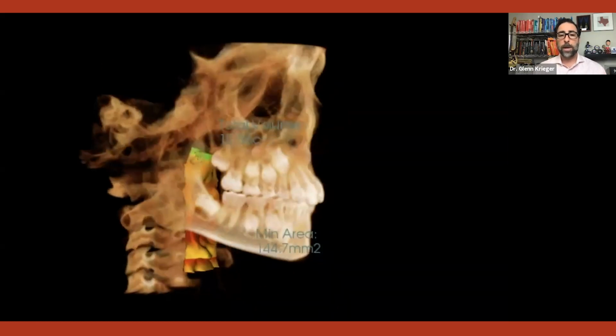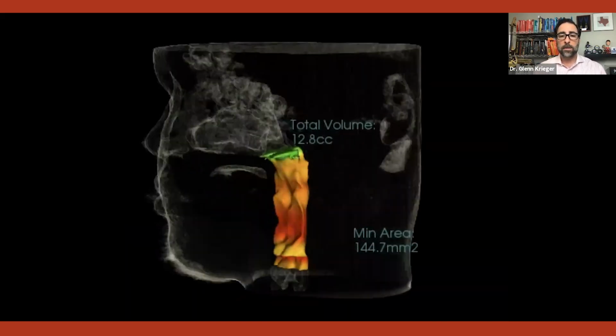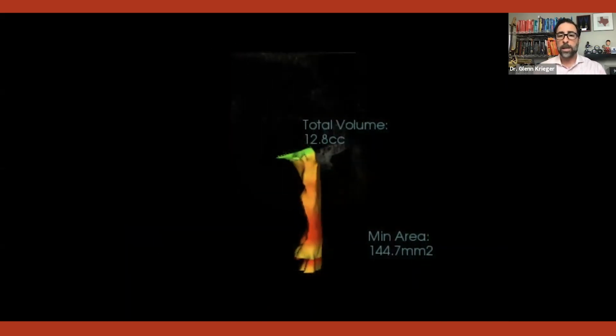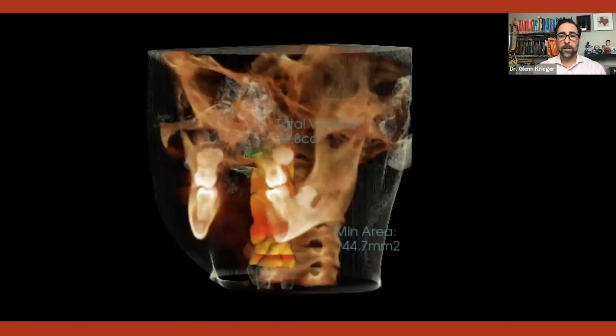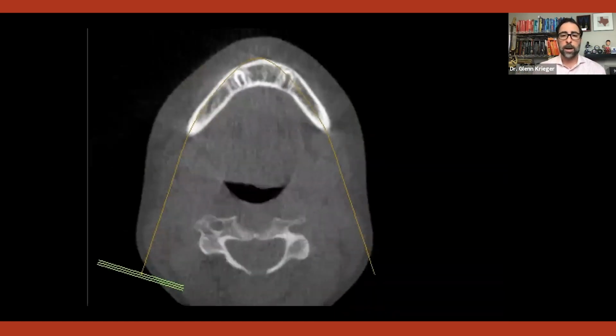And again, if you want to play with the bells and whistles on the CBCT, on my iCat Flex, which is what I use, we can play around with all of them, looking at airway, sinuses, the whole 9 yards, and see everything. But again, we can see things very, very differently when we rotate and play with this. We'll get into this more in just a little bit. We only have 45 minutes to an hour today for the entire session, so I don't have the opportunity to really do a deep dive into this. But let's go where we are right now.